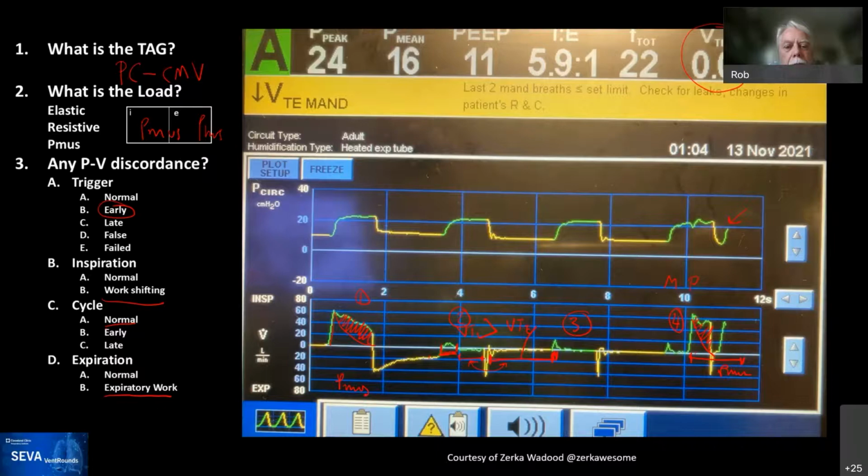And so there's a question here. Do the ventilators deliver fixed amounts of pressure irrespective of the airway pressure at the onset of inspiration, or do they just deliver the flow to maintain the target pressure? Rob, that's a question for you. They deliver as much flow as it takes to deliver the target pressure, generally above PEEP. Thank you, Rob. It depends on the mode in the ventilator, but in general, pressure control means that the ventilator controls flow to give you the target pressure for the duration of the inspiratory time.